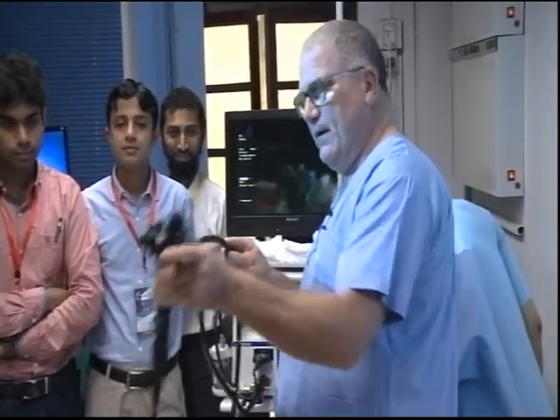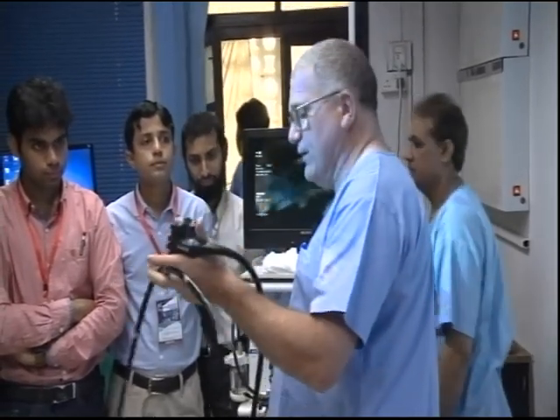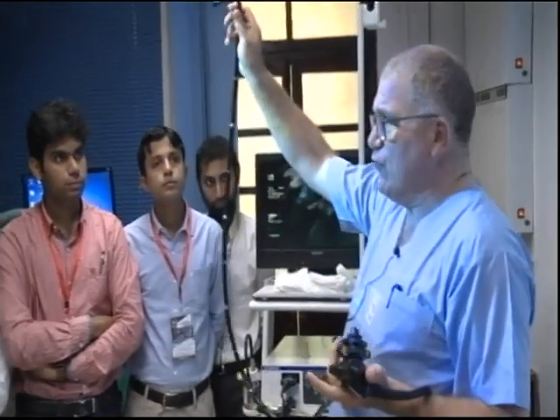Right, let's start. So here we go, the scope. The scope itself is split into three sections. So we have the control unit, umbilical, and the insertion tube.